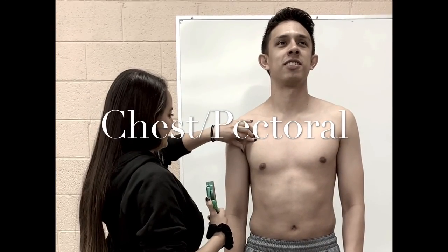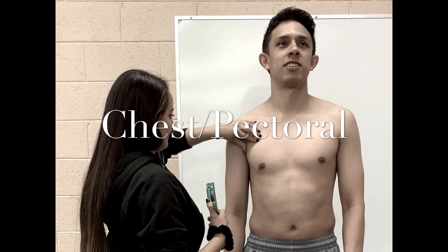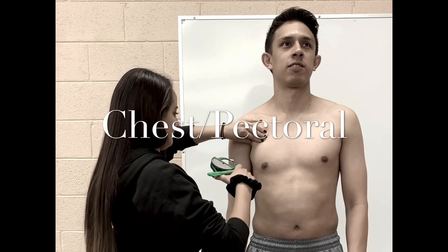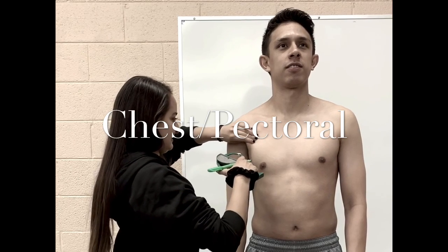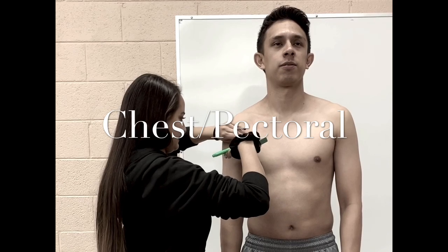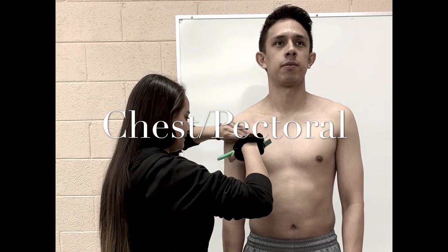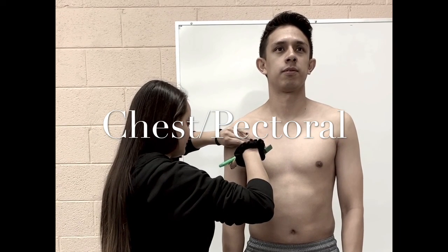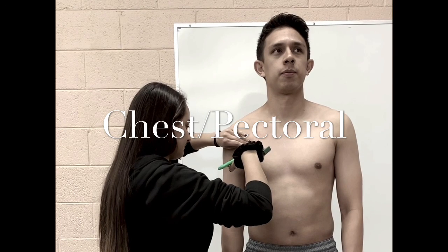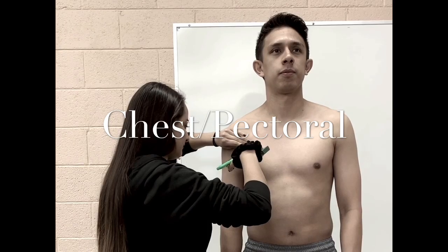Lastly, for the chest/pectoral site, it will also be a diagonal fold. For men, it will be located 1/2 the distance between the anterior axillary line and the nipple. For women, it will be located 1/3 of the distance between the anterior axillary line and the nipple.